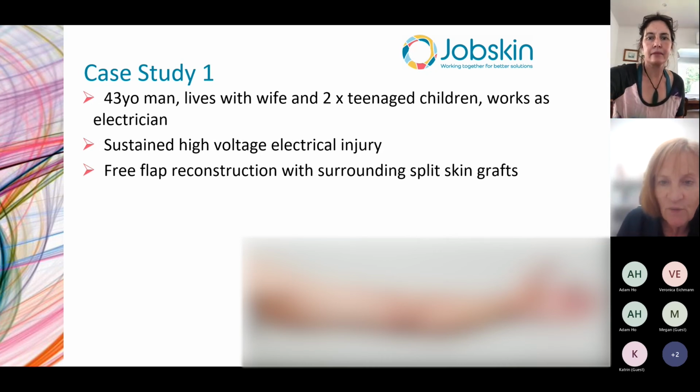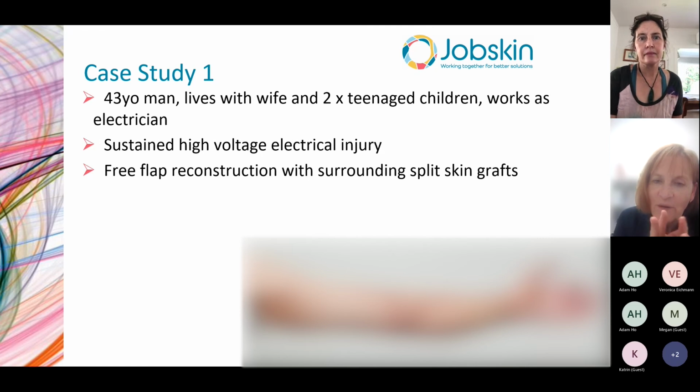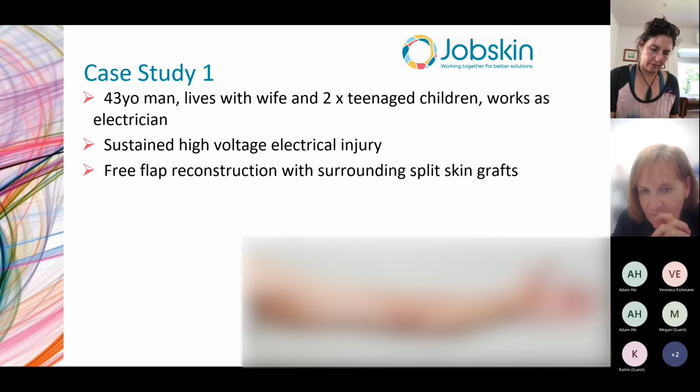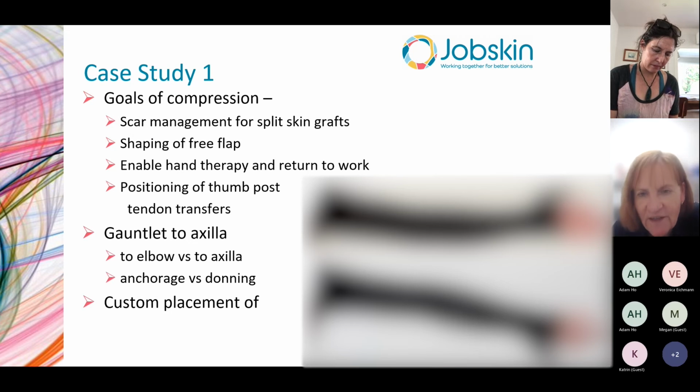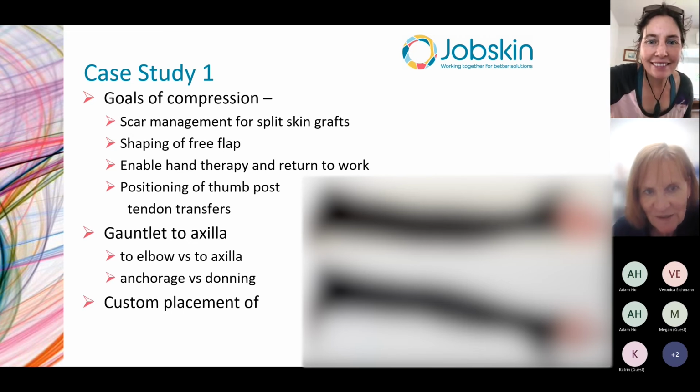So there were a couple of different trials for garments for him. He was initially put into a forearm length garment because there was concern about going across the wrist and the elbow, but in fact, with a recognition that he needed compression on the upper arm, he was fairly quickly moved into a full length arm sleeve. And I apologise that the details are harder to see when it's a black garment, but it's a popular choice.